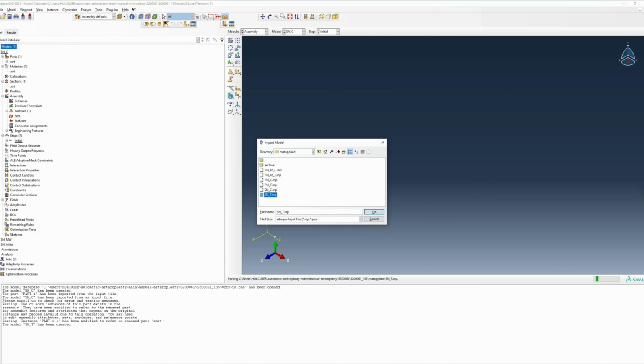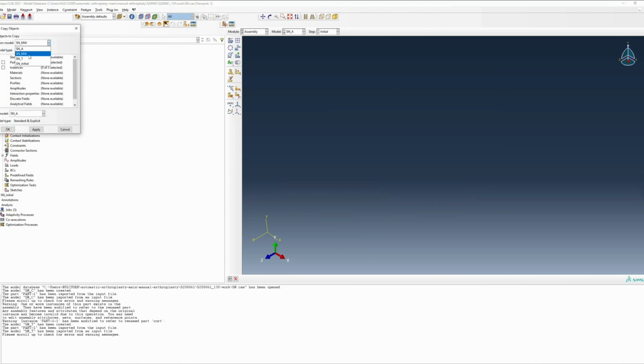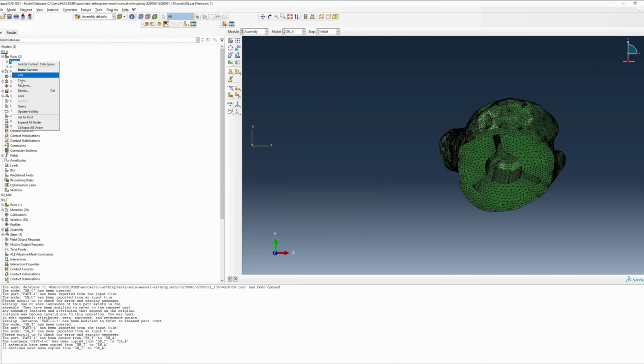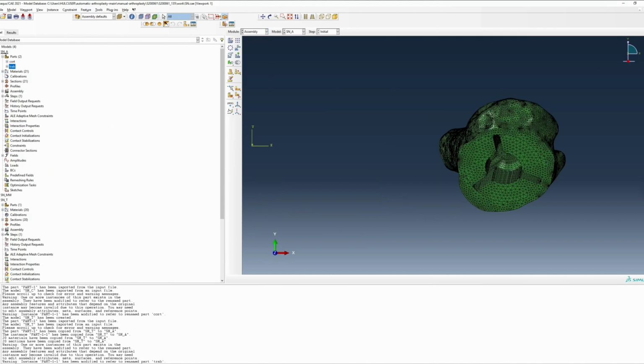Separately import your material applied trabecular model, and it should show up as a new model. Here I've just found that it's easiest to rename your new cortical model as your working analysis model. You can now copy over all parts, materials, and sections from your trabecular bone model. With our bone models imported, we should now be able to merge them and get started with our analysis.